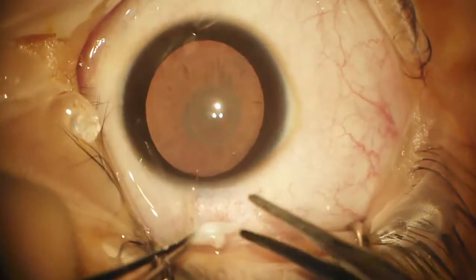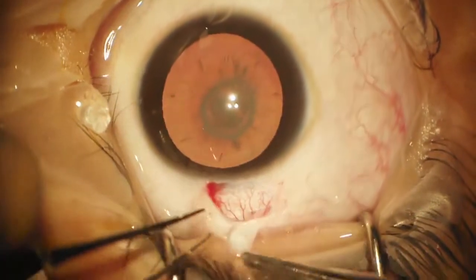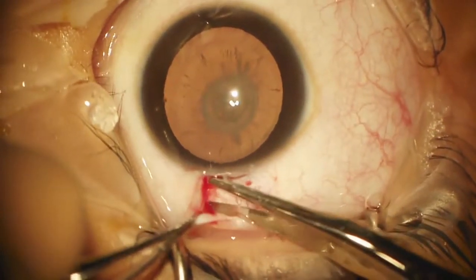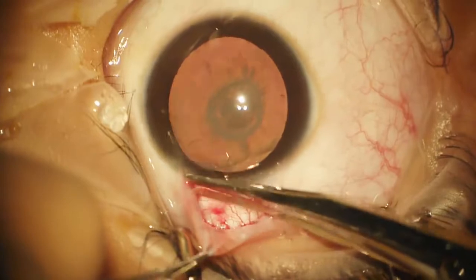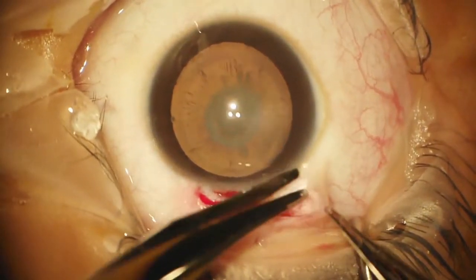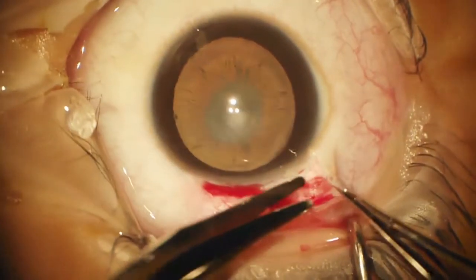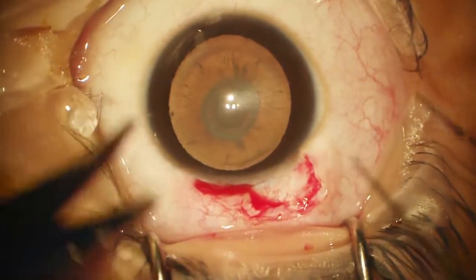He has this bilaterally, so we're operating on his right eye today. Because it's a posterior polar cataract, I'm concerned I may have to do something to the posterior capsule — either because there's an opening in the capsule, or that very dense plaque will not be able to be peeled off, requiring a posterior capsulectomy. So I'm making a slightly larger peritomy, because I may have to do a vitrectomy through the pars plana. The entry point will probably be over here. It's easier to do that dissection ahead of time rather than after the eye has already been opened and operated on, so we'll plan ahead.